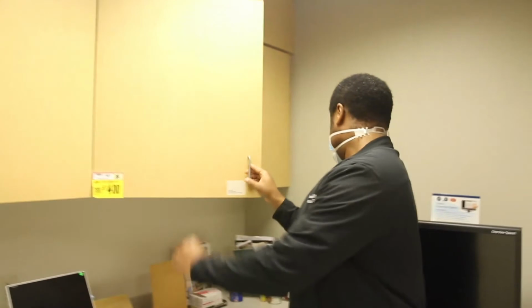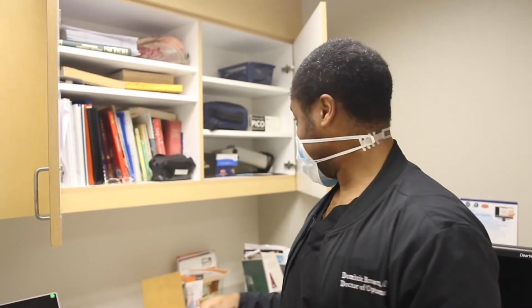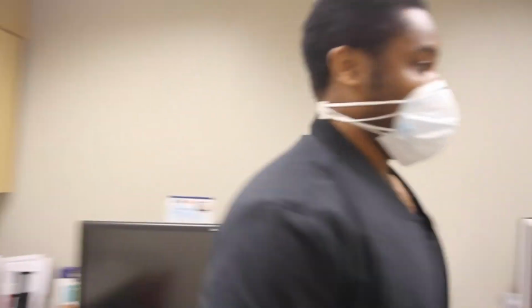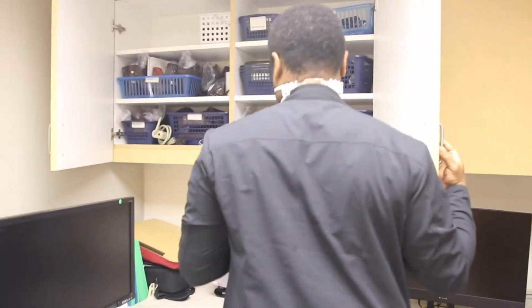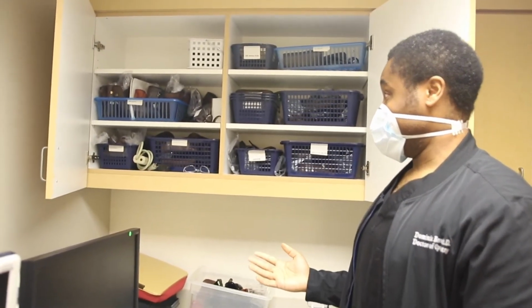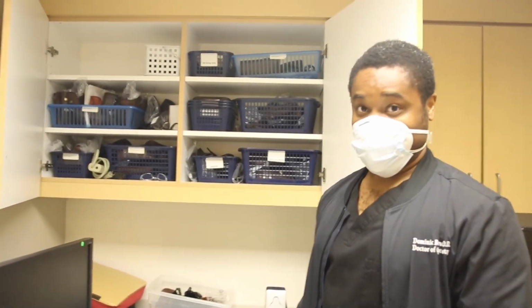And in tandem with that, we have some books. There's also some canned goods, some magazines laying around just to make sure that patients feel comfortable with their everyday environment using the low vision devices. On this side, we have a lot of our tints. So sometimes patients become very light sensitive due to their low vision pathologies. So these help them address any indoor, outdoor glare, and also helps, again, rehabilitate their low vision goals.